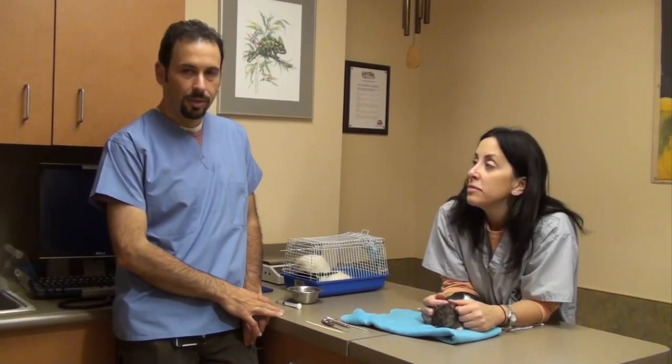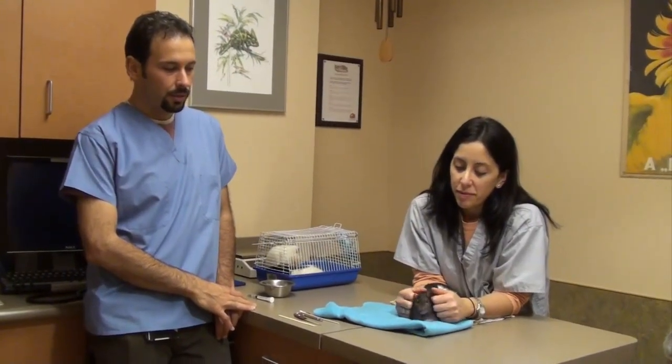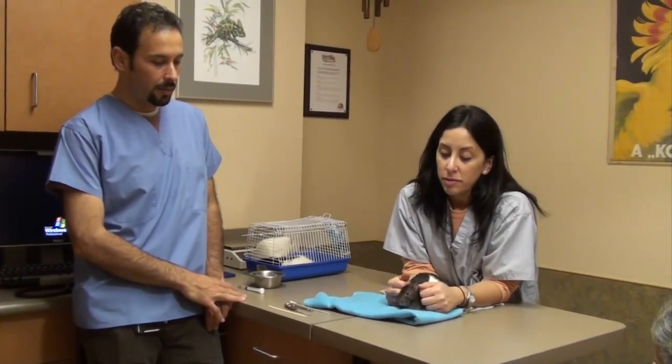We're going to demonstrate tooth trimming, specifically trimming the incisors on this rat that has a malocclusion. His teeth don't line up normally so they don't wear normally, and he needs to have them trimmed frequently — both so that he can eat and for comfort reasons, and to prevent any trauma.